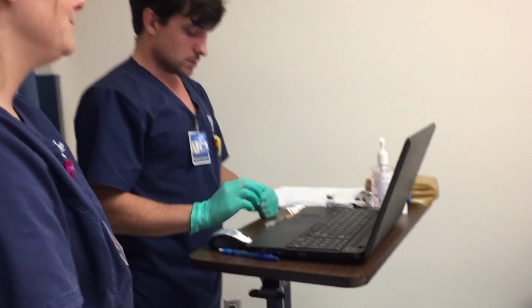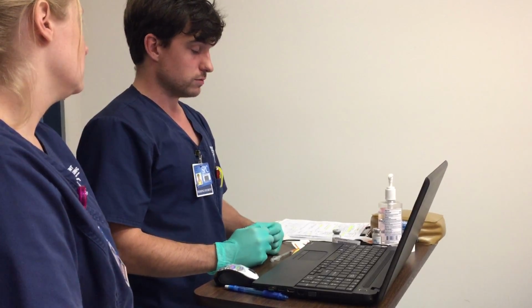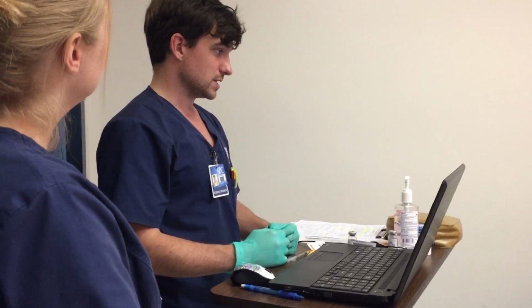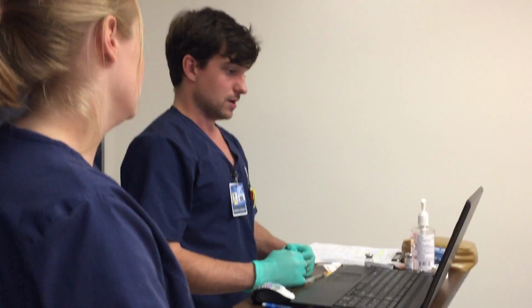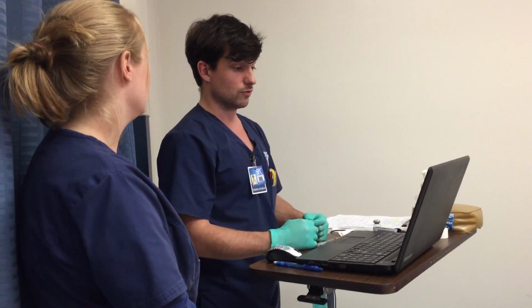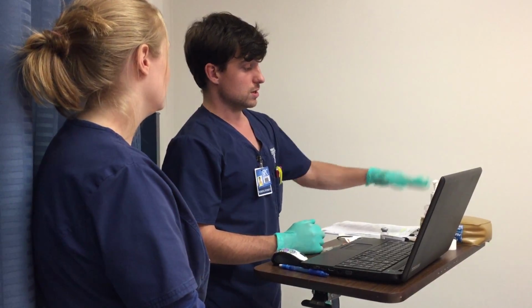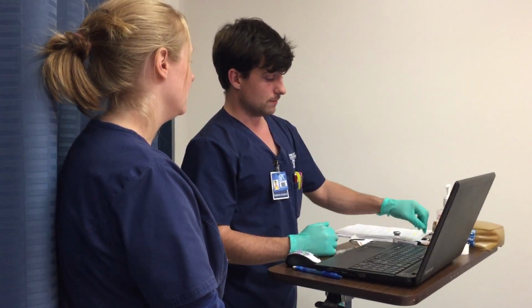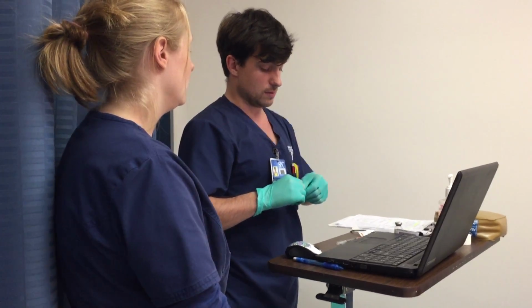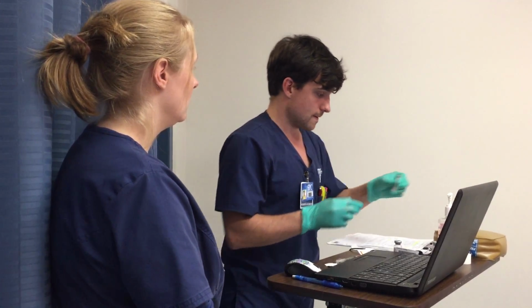Now we have to ask him a couple more questions. Mr. Glenn, where would you like this today? I'll take it in my abdomen. Perfect. That's an acceptable place. We're going to make sure that we don't pinch because it's unacceptable. We're making sure that we're not going to rub in afterwards. That's unacceptable. When we do this, we are going to alcohol swab him, which I'm going to do right here. And if we do administer it, we're going to hold it for 5 seconds to make sure the drug is fully in there, okay?